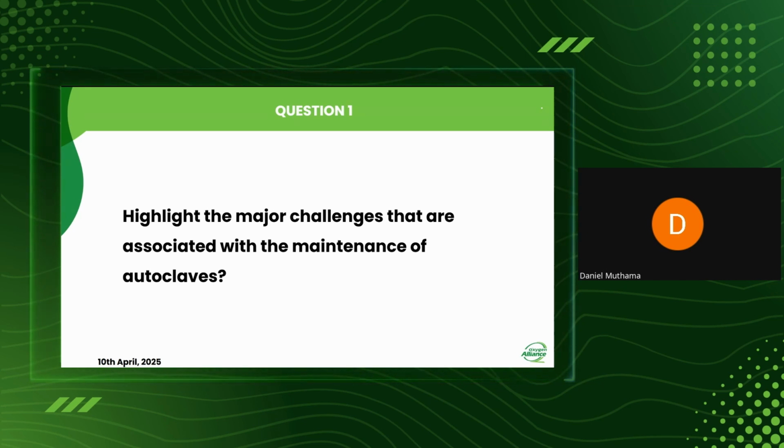Before, when I used to put in the element, I didn't put enough Teflon thread. When you start heating the autoclave, there are leakages. So when we are repairing that, as an engineer, it is very important for us to check.